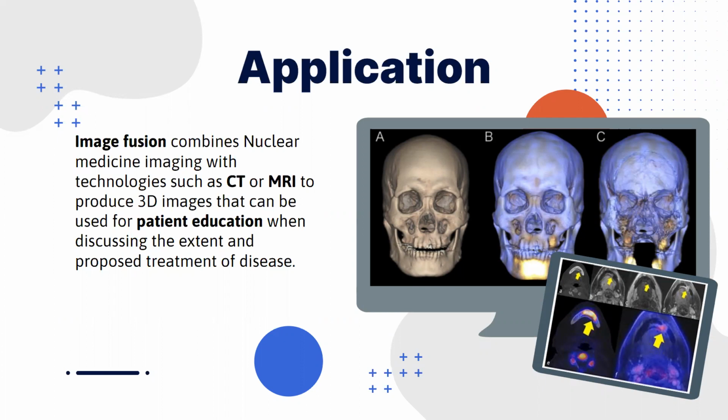Some imaging units can perform nuclear imaging diagnostic scans at the same time as other imaging modalities, such as SPECT combined with traditional CT, and PET combined with CT, or PET/CT. PET MRI is an emerging imaging technology and is only available in some locations. When these images are combined, the 3D image with highlighted areas of disease is an excellent tool for educating patients and communicating treatment needs.